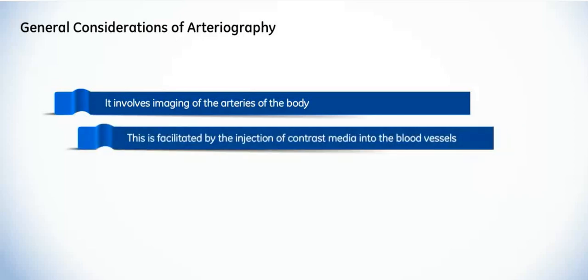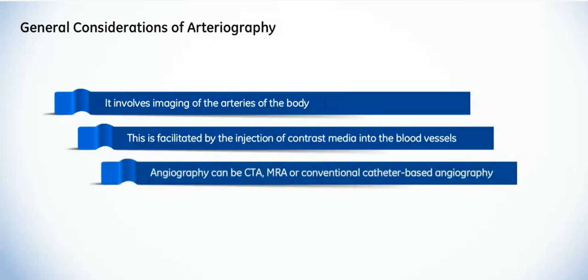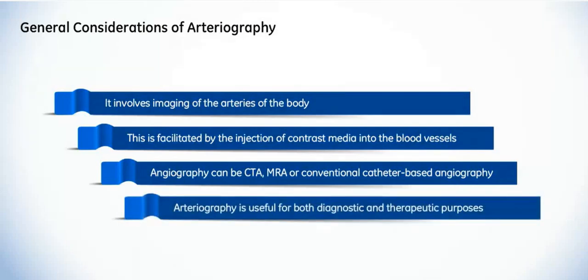Depending on the modality of imaging investigation used to visualize the blood vessels, angiography can be computed tomography angiography, or CTA, magnetic resonance angiography, or MRA, or conventional catheter-based angiography. Arteriography is useful not only for diagnostic purposes, but also for therapeutic intervention.